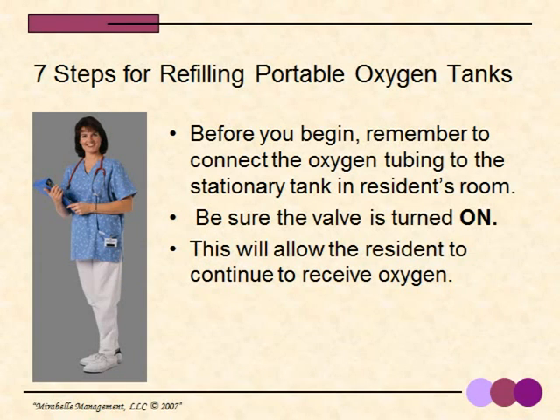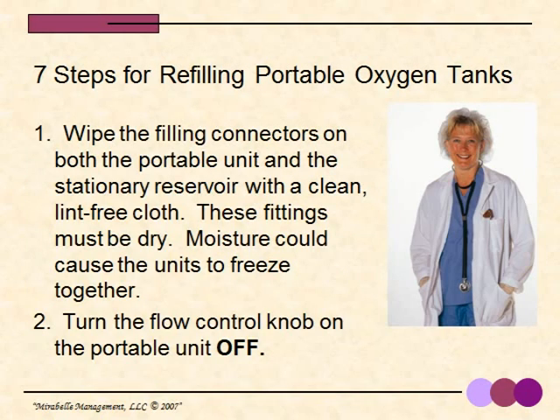I'm going to go through the steps necessary for refilling a portable oxygen tank off of the large cylinder or reservoir. But before you begin, remember to connect the oxygen tubing to the stationary tank in the resident's room. And be sure the valve is turned on, as this will allow the resident to continue to receive oxygen. You will have an opportunity to demonstrate this skill to your nurse. So I will go through the steps now.